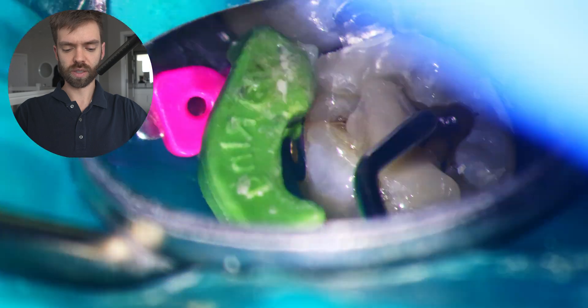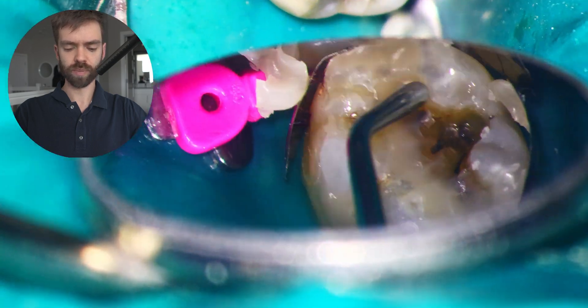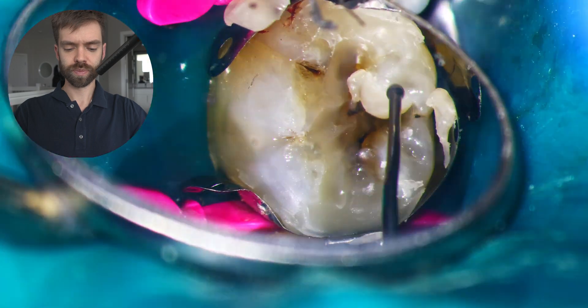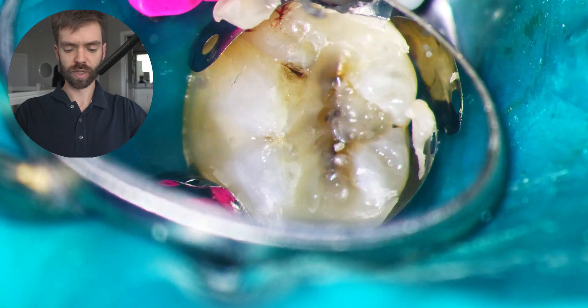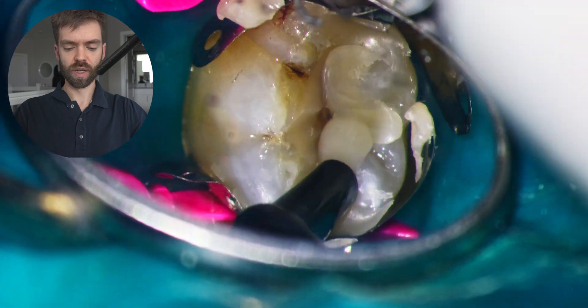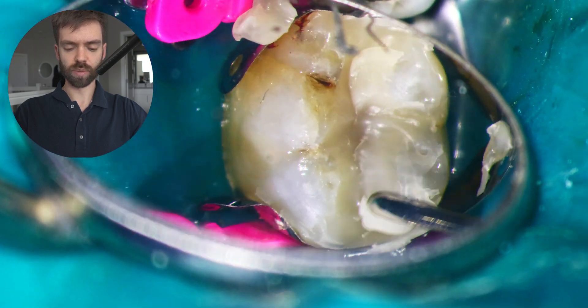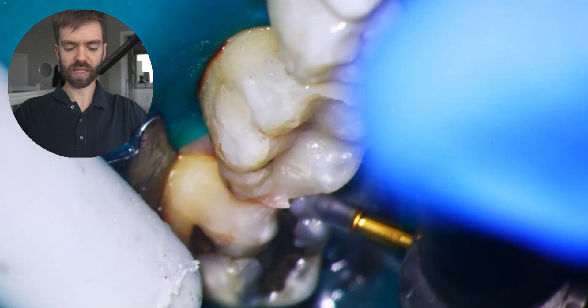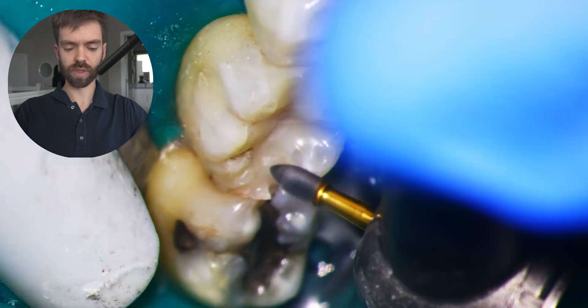Keep going here, continue to add material, build the cusps back to how they were before. And make sure that none of the little cavernous areas within the preparation are missed. That's why I'm going to pack some material in before we do those final increments.